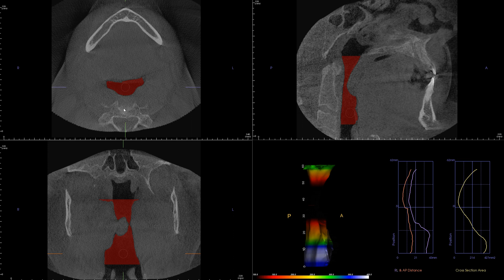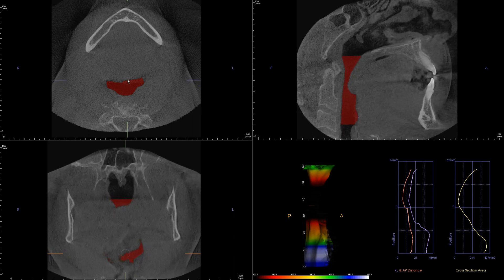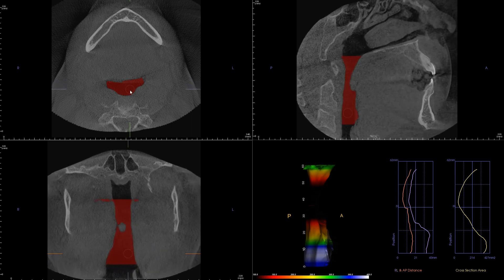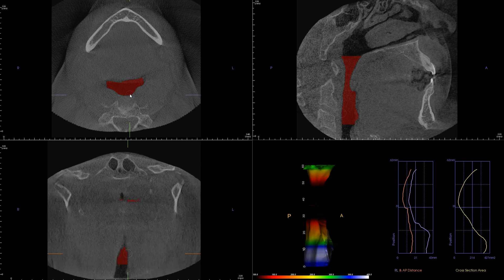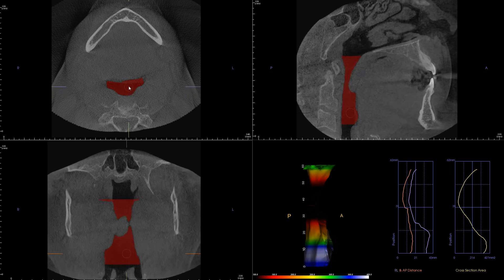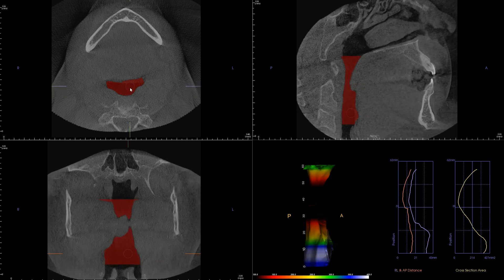We can also take a look at the coronal view. It's probably more difficult to appreciate the overall volumetric change of the airway, but that is the coronal view.